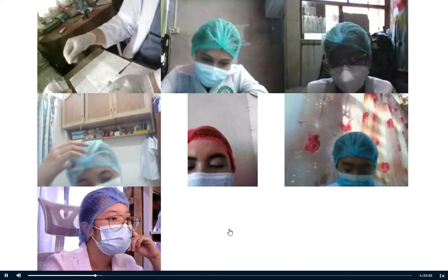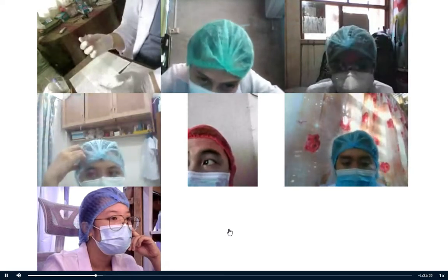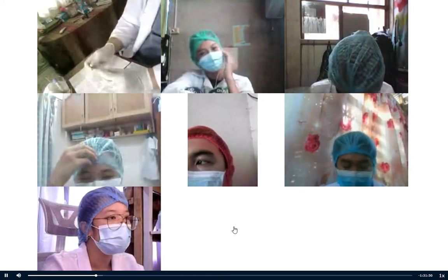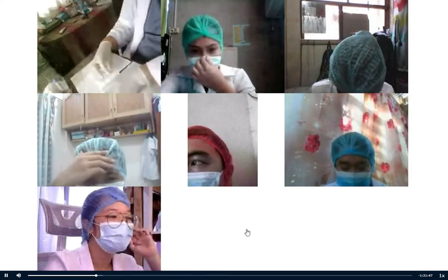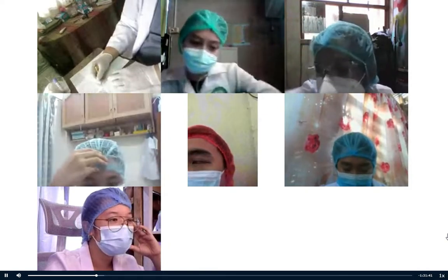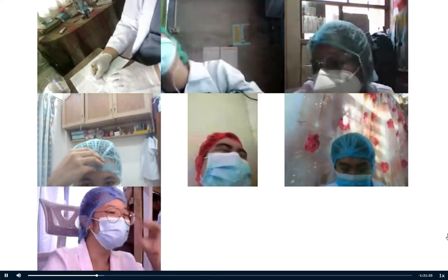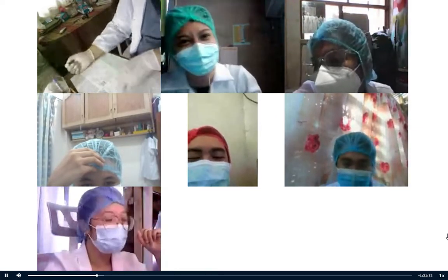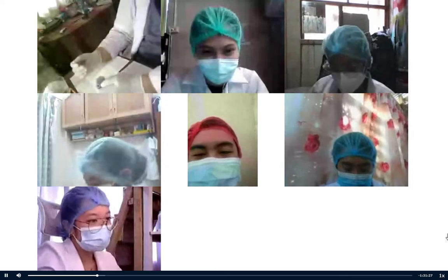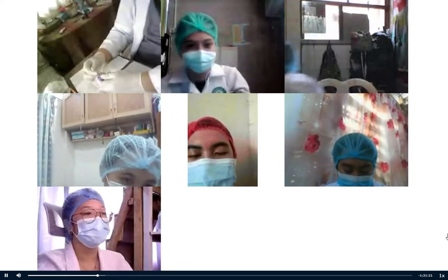Then you air dry that. So these are examples of slides I made. This is for the patient Trixie Destacamento and patient Kate De Latina. So ulitin ko, class, ha? One more time. So prepare your slide. You label the slide. Let's say Miss Claire Amar. Be a good patient. And then once you have your blood, once you have labeled your slide, check your blood for any problems, if there are clots, if it is hemolyzed, if it's underfilled or overfilled. After that, you place the drop of blood.